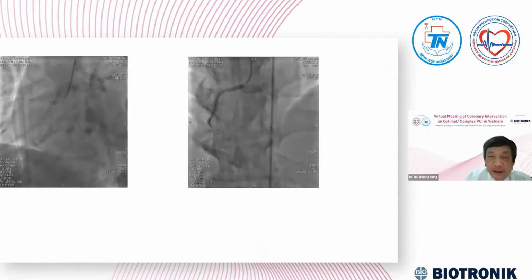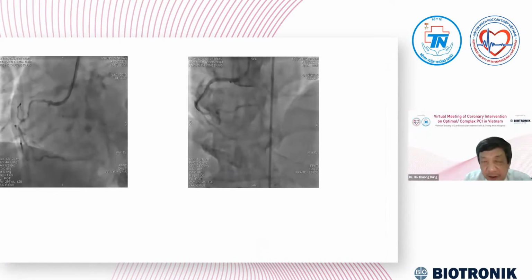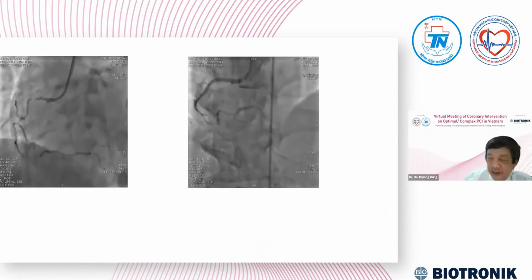I don't know, after we do stenting for the right coronary artery, how much it can increase blood flow to the left. I don't know, but it made me feel more confident going to the left.